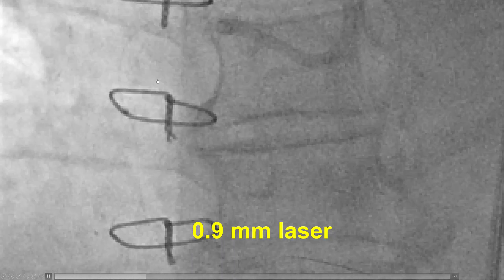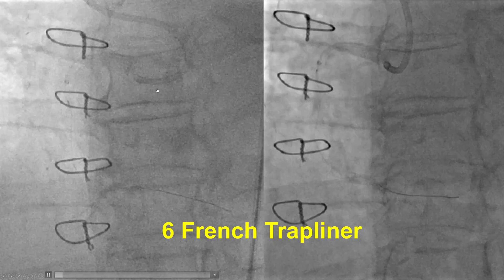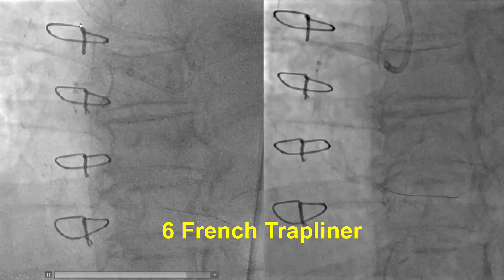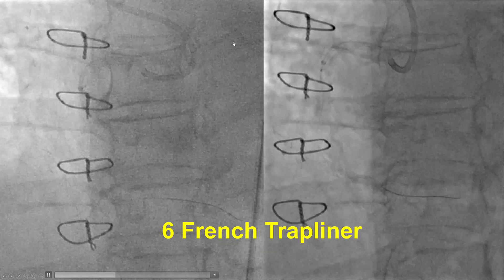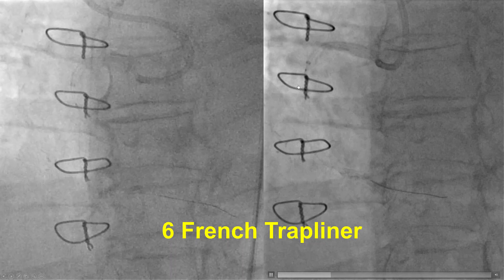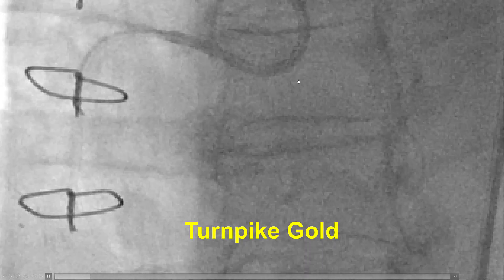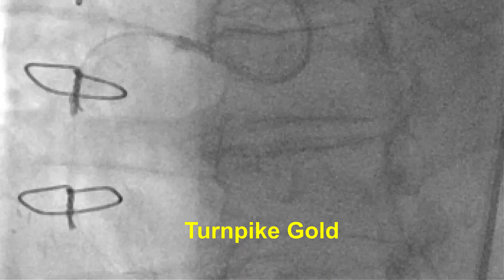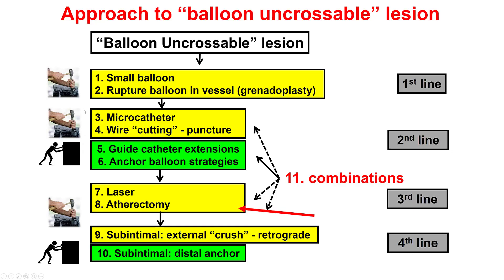We then tried with the laser, and despite multiple passes, we were also unable to cross. We increased support by using a 6 French Trapliner that reached almost all the way to the lesion, but again tried several balloons and laser — we were unable to cross. We also tried the Turnpike Gold, a microcatheter designed for screwing into the lesion, but it also could not cross through this lesion.